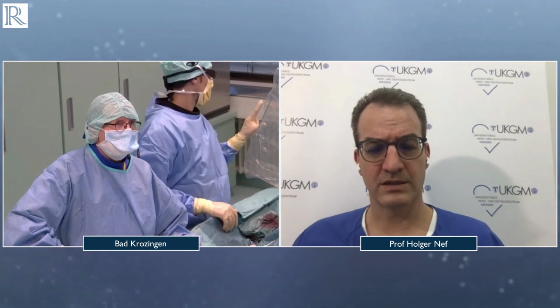Well, this is perfect. We never experienced this. I want to confirm that this kind of ventricular capture is a very, very rare event, and of course this was now observed. But if you look at the data, and if I look at my own experience, we have now done more than 120 IVL procedures, and there was never a complication which was device related.